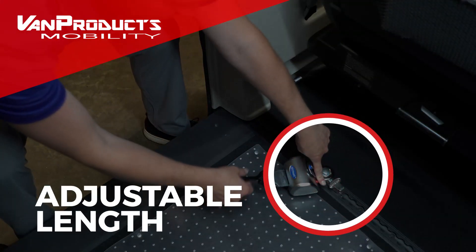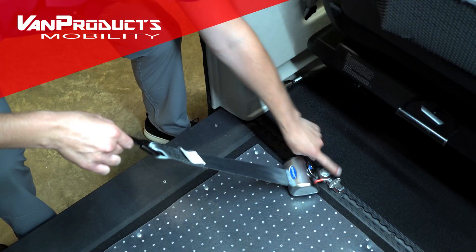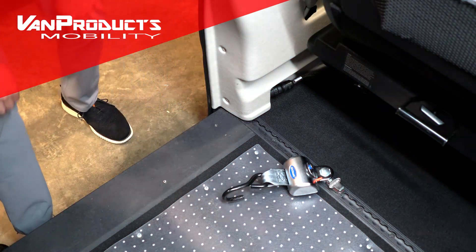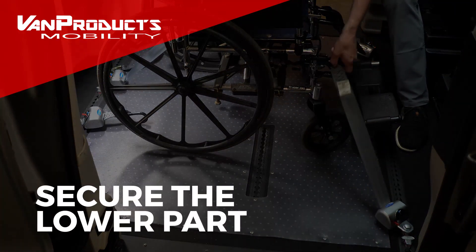The red button on the back of the tie-down allows you to pull the hook out and secure it to the chair. It's a self-tensioning tie-down, so it will secure and automatically tighten when securing the wheelchair.